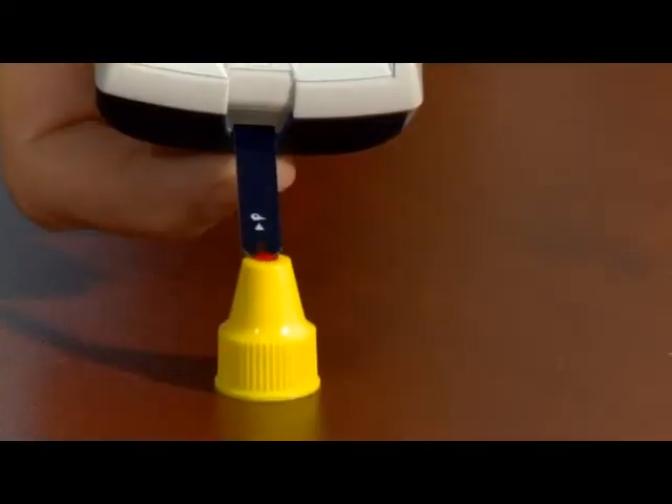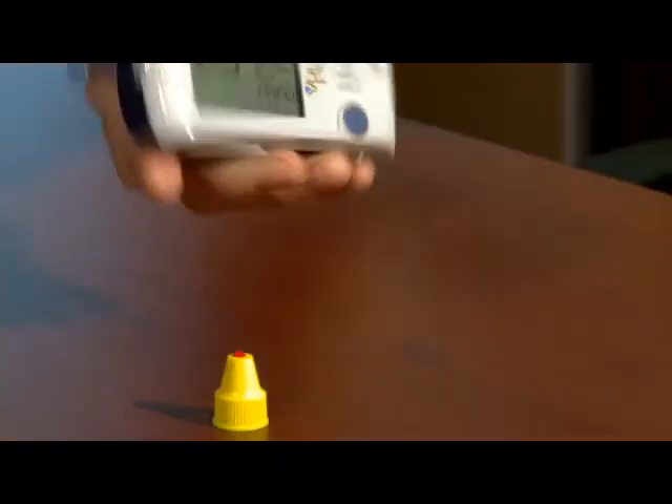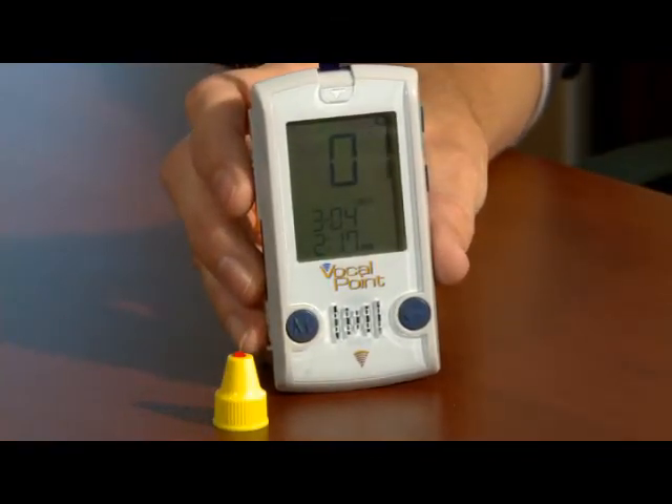Holding the meter at an angle, touch the tip of the test strip to the drop of control solution. Once the meter starts to count down, remove the strip away from the drop.